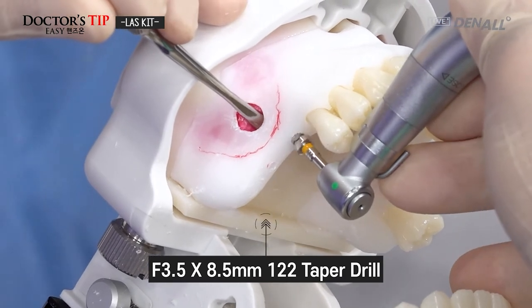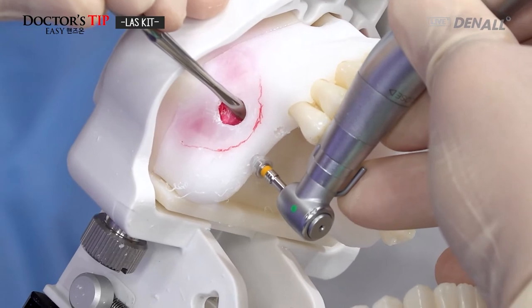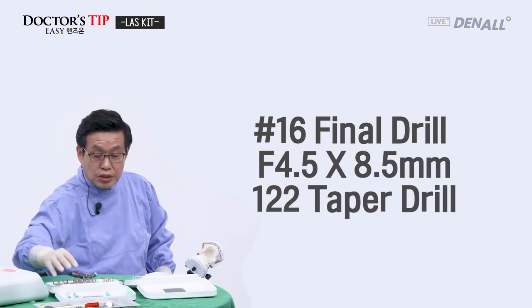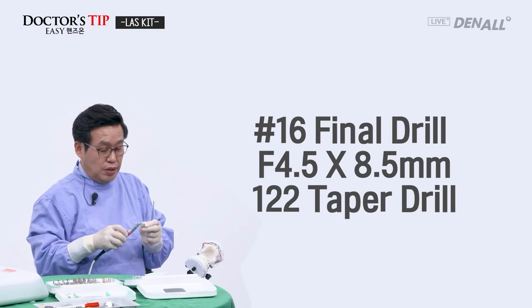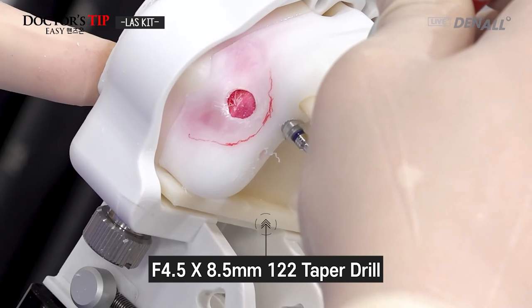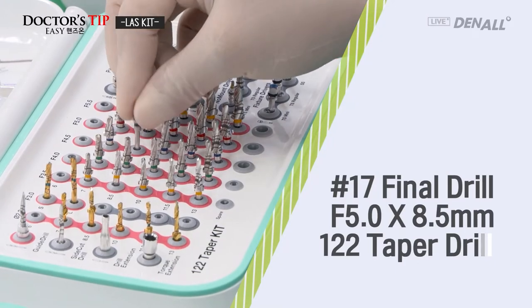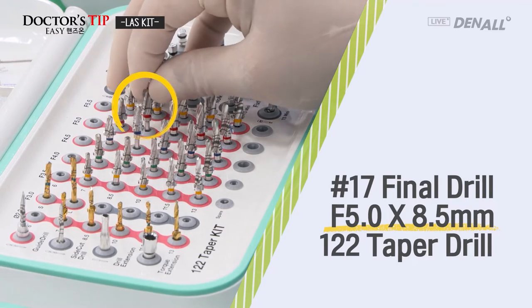And like this. And also here, fixture 3.5. And number 16, we'll go up to 4.5. So with the 8.5 drill, I'll do the final drilling. So number 16 is drilled with the final drill. Fixture 4.5, and number 17 is 5.0, 8.5 millimeters final drilling.